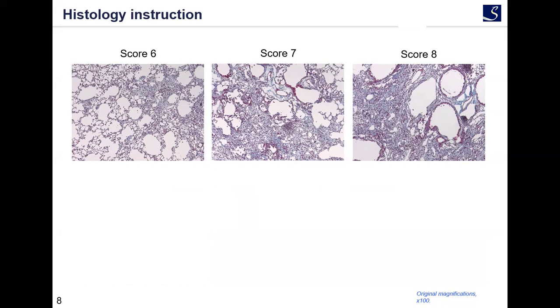Score 7 is a distortion of structure and large fibrous area. Score 8 is a total obliteration of the lung. And these are the examples of the staining.